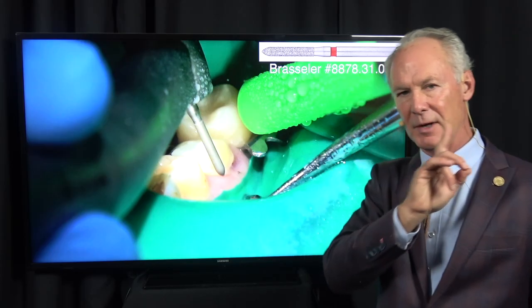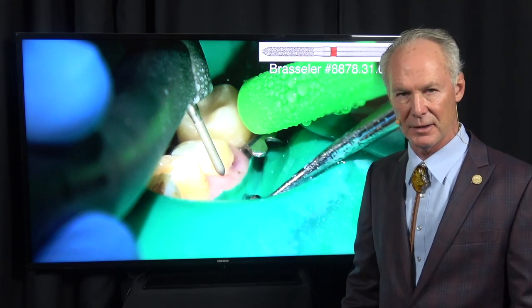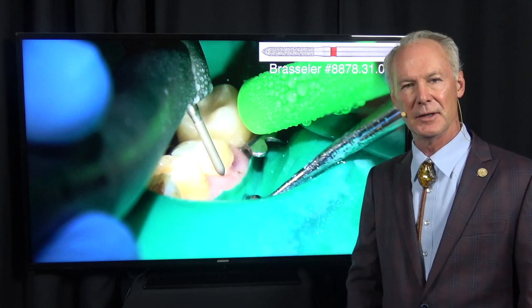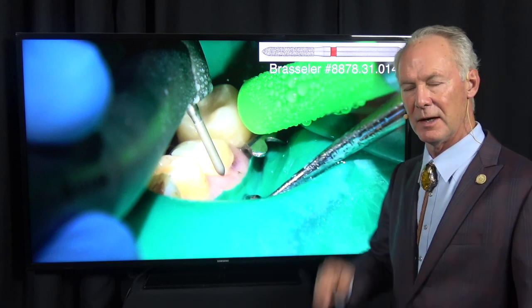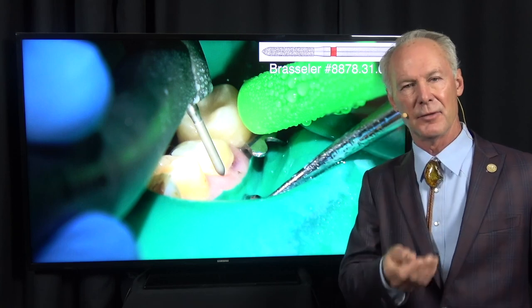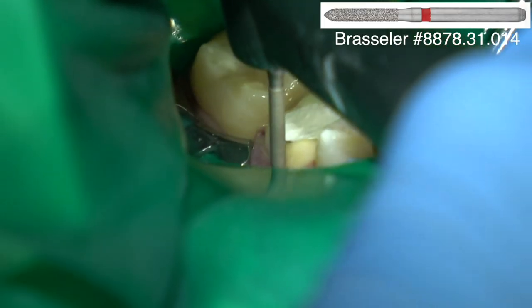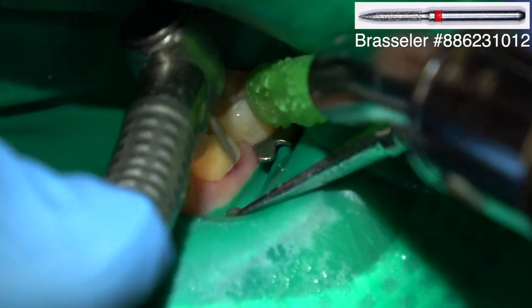That's why I'm not a real fan of full crowns on anterior teeth if you don't have to place a crown. I'd rather place a veneer and preserve that tooth structure, especially if endodontics has been done on the tooth. If you don't have to place a crown or a veneer on an anterior tooth, that's even better, because the tooth will become more brittle over time and it's more prone to fracture if you remove tooth structure for a crown or a veneer in addition to the root canal. I'm probably a millimeter from the gingival margin and just fine-tuning it with that flame-shaped diamond.